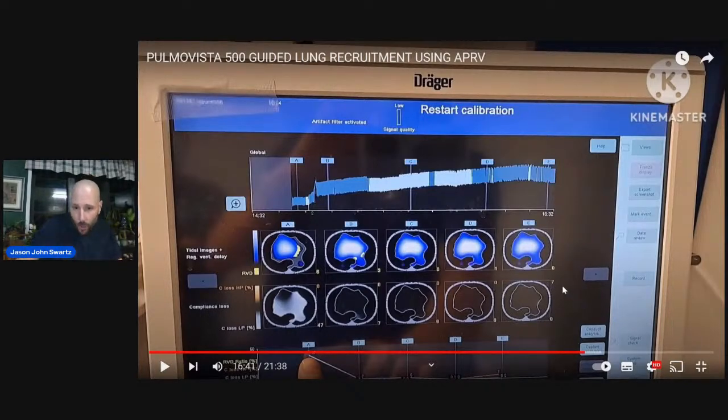And do you know why this one has 7? Did you notice, look at the impedance values. What is the angle? The impedance values are going upwards. So from the very start, the whole time that we're there, it's still recruiting, guys. More and more and more. Even here, it was still recruiting.